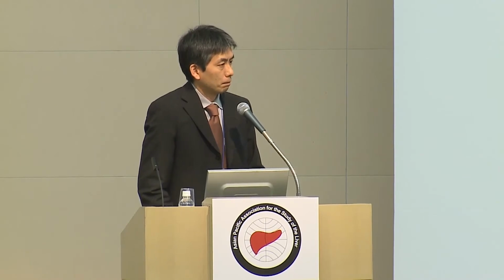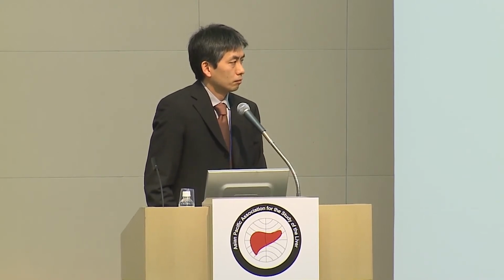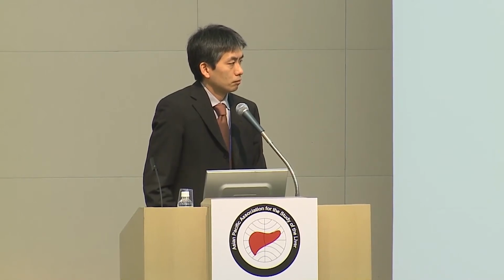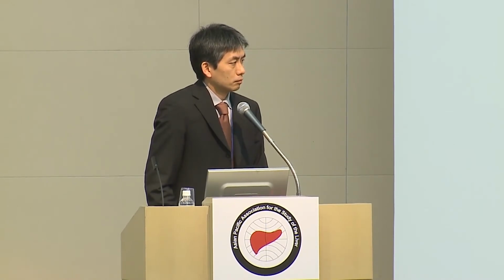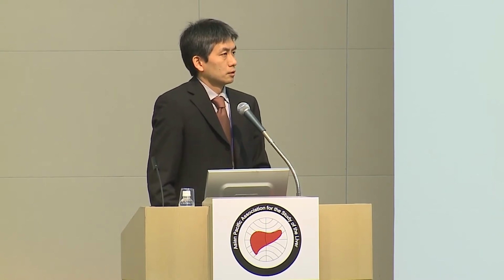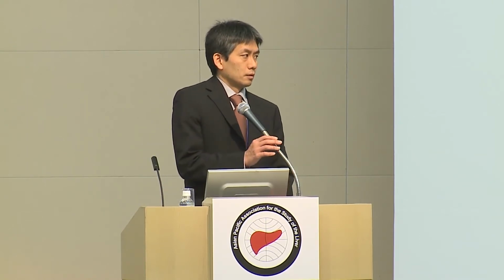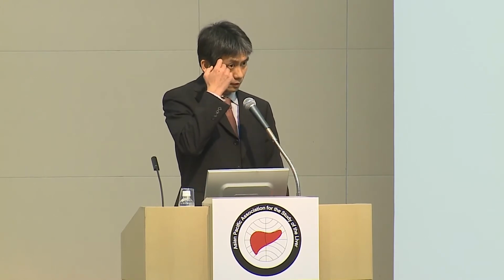Question? You mentioned that Sonazoid imaging is useful for estimating the degree of tumor differentiation, but how accurate is this method in terms of tumor differentiation? Do you have any definite value, such as sensitivity or specificity?